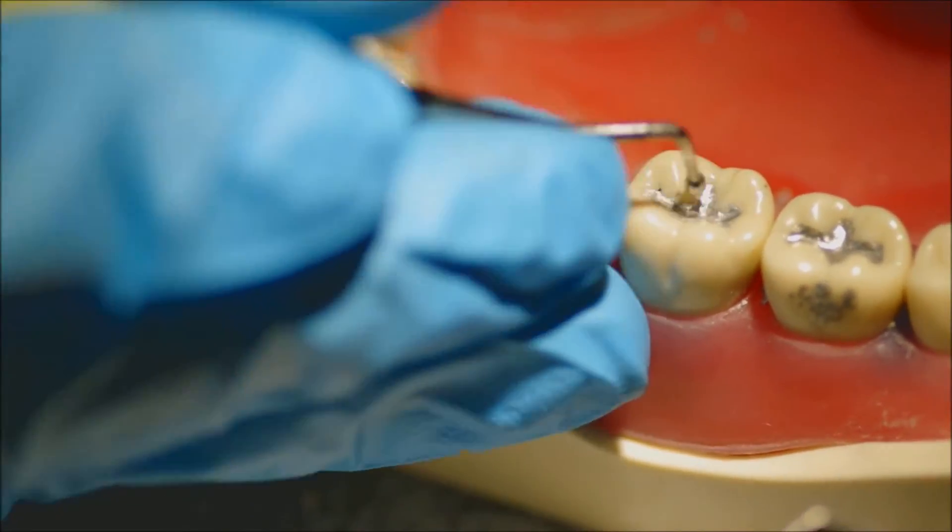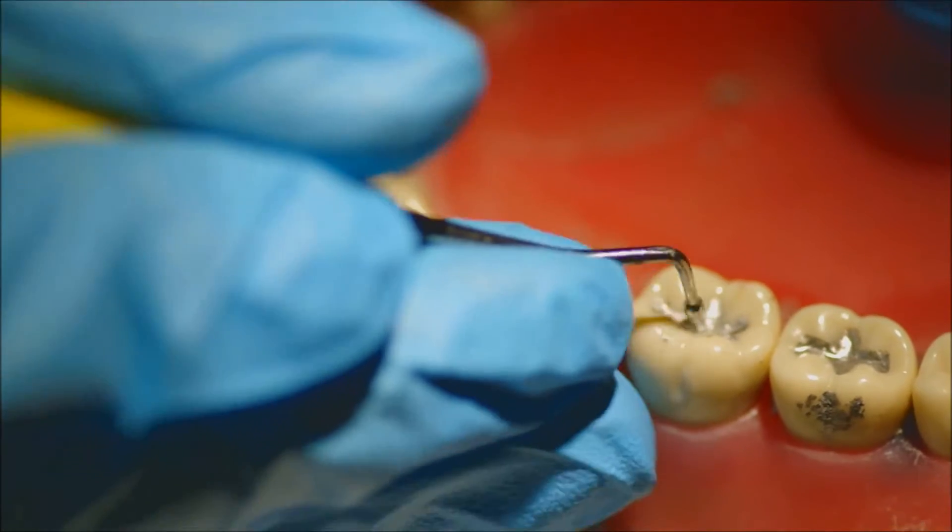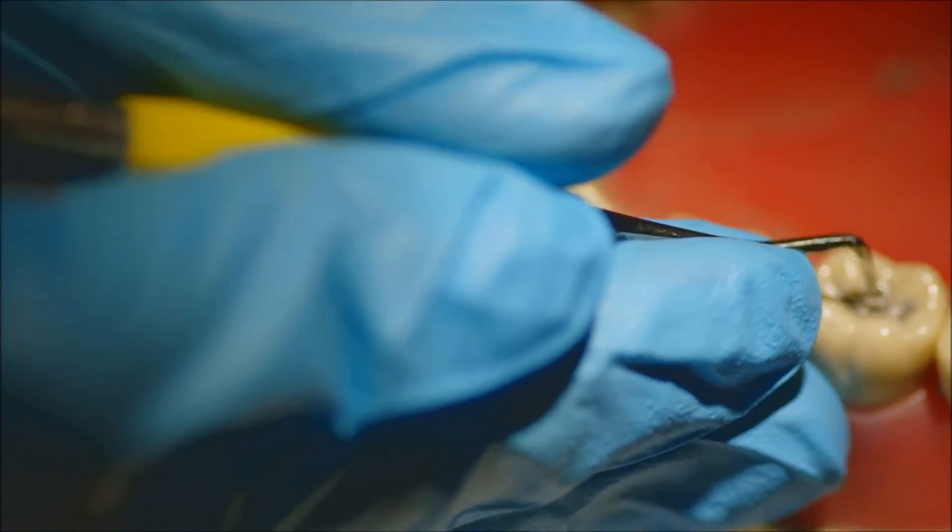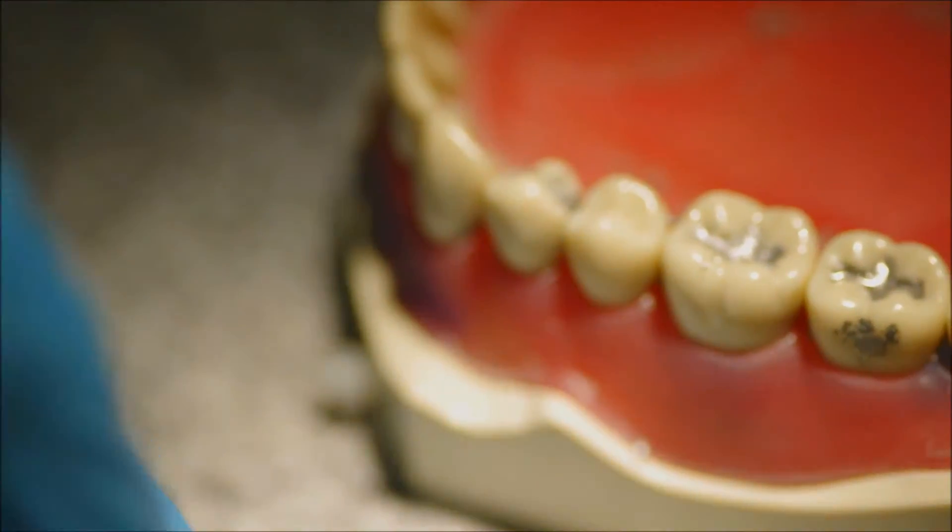In order to refine, you can go in with a ball burnisher to smoothen the surface after you've done your initial bit of carving with the acorn.